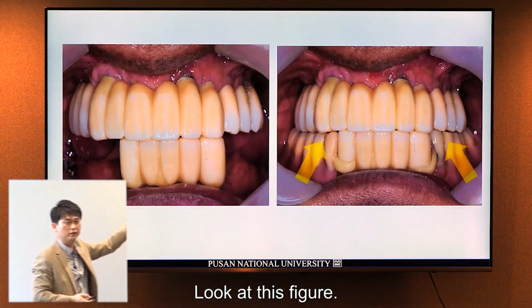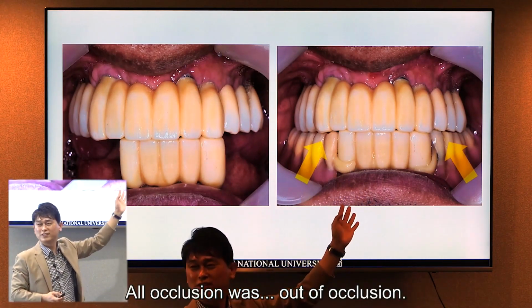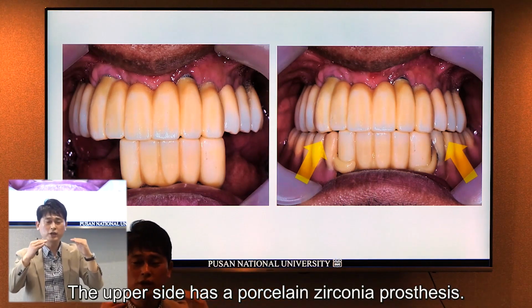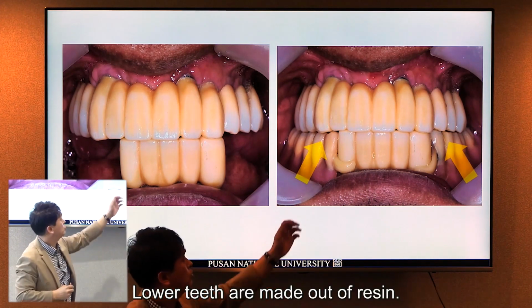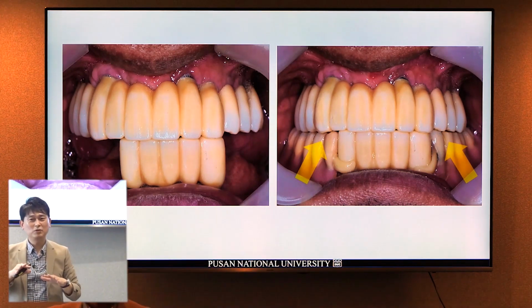Look at this figure. All occlusion was out of occlusion. What's the reason? The upper side has the porcelain zirconia prosthesis. The lower tooth is resin teeth. Severe wear would occur.